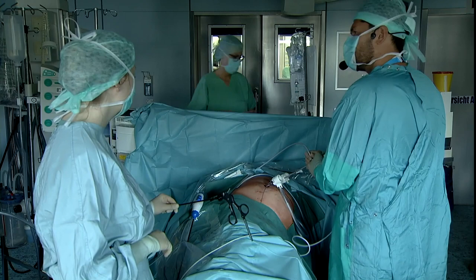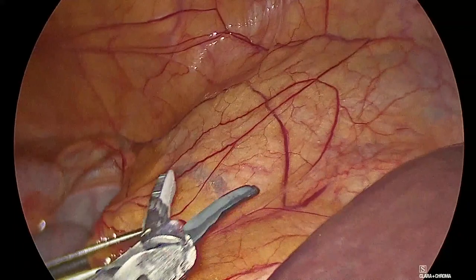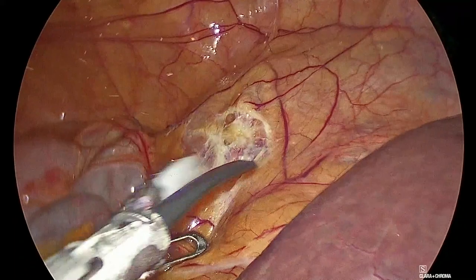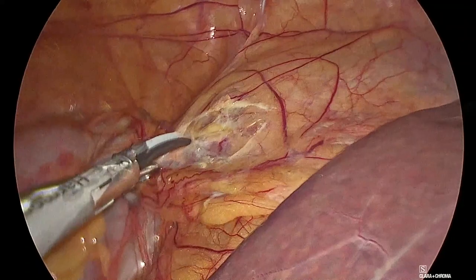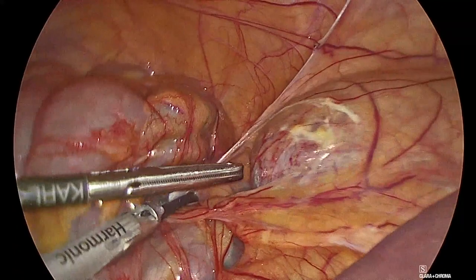Okay, good. So we're using, as I said, the harmonic scalpel, as well as our energy dissector. And here, you know that the harmonic is the ultracision, so ultrasonic energy. I think it's a nice dissector. I normally use the LigaSure or the EnSeal, which is a bipolar energy, but it's absolutely fine to use whatever you want, including monopolar and bipolar.